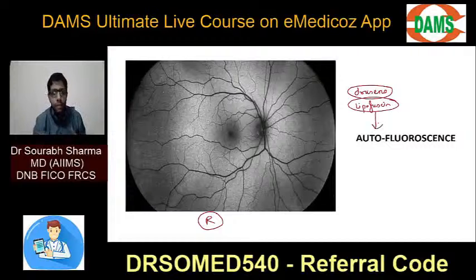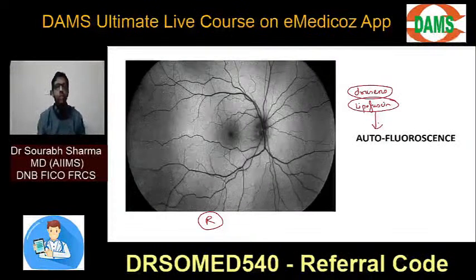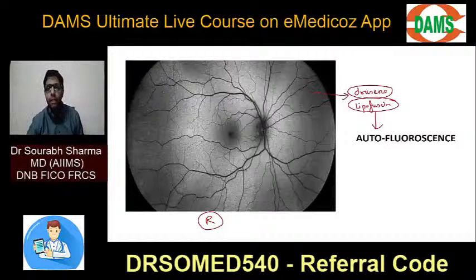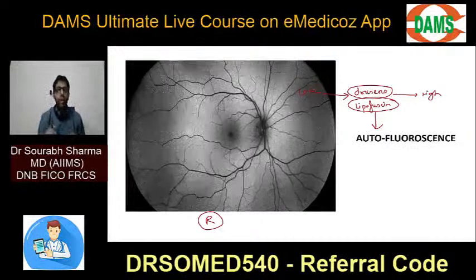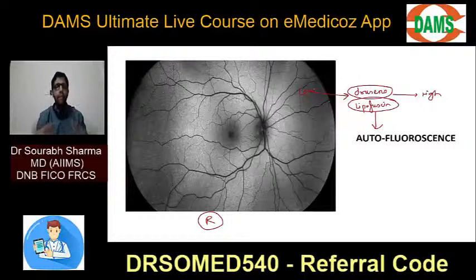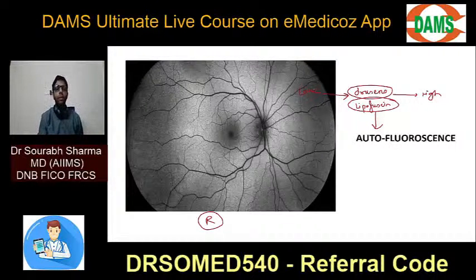They themselves have a property of fluorescence, autofluorescence, in which if you throw a low wavelength light at them, they will emit a high wavelength light. So in those depositions, when these two are deposited in the retina, you don't need a dye. They themselves emit a higher wavelength when a low wavelength is given to them.